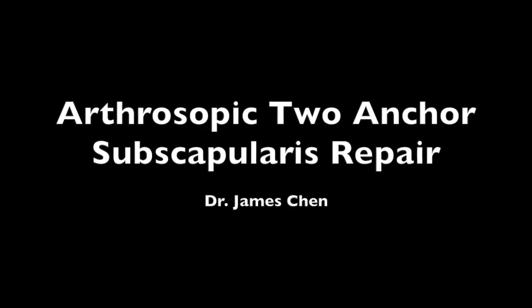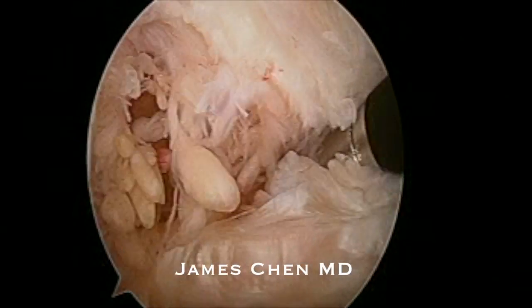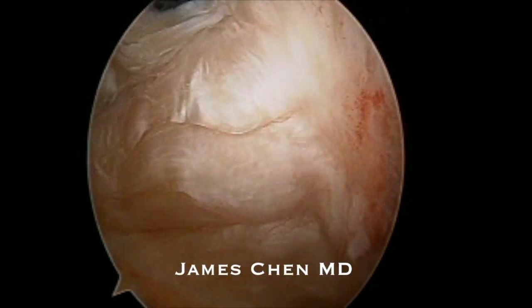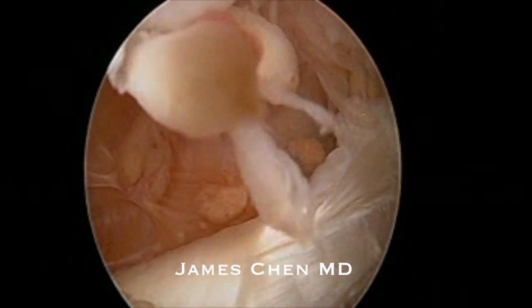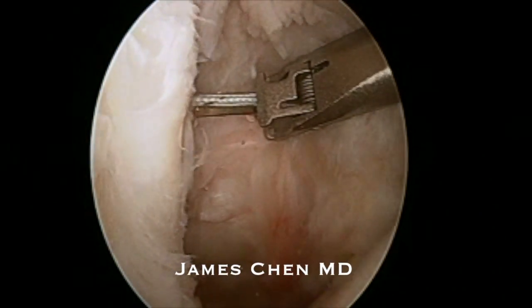This is a video of an arthroscopic subscapularis repair using two anchors. Here I am looking from the posterior portal of the glenohumeral joint. You can see a very large superior subscapularis tear.